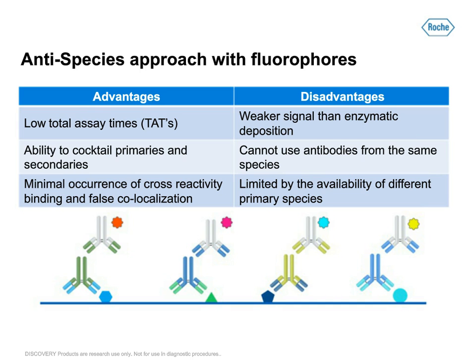So unlike the previous method, where you have the ability to cocktail and detect all at the same time, in this method you actually have to detect in sequence. And one of the methods you can incorporate, which we've put to practice on our platform, is you can elute your detected antibody with heat. We do offer a denaturing agent as well, which is just a mild acid solution. So you lower the pH on the slide in order to elute that antibody, affect the affinity of that primary that's bound, and elute it off the slide.